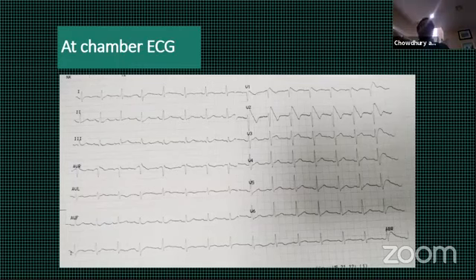Right. I totally agree. You have to be familiar with this shape, and you need to know that this is characteristic of Brugada. That's why I said, I will be very sad if anybody attending this meeting will ever give thrombolytics or stat coronary angiogram for this. However, having said that, we have been fooled. Many people have done coronary angiogram, and after that, they call the other guys.